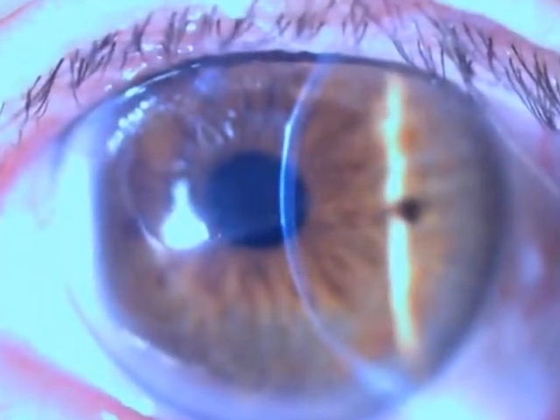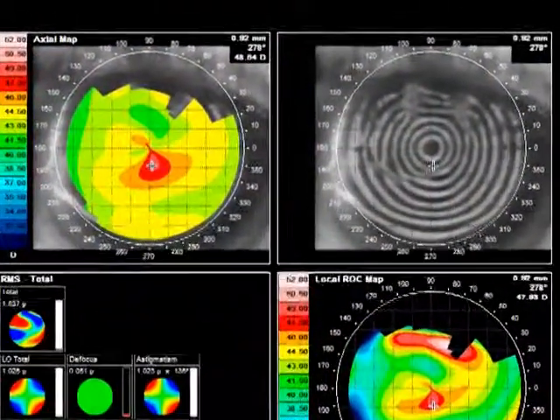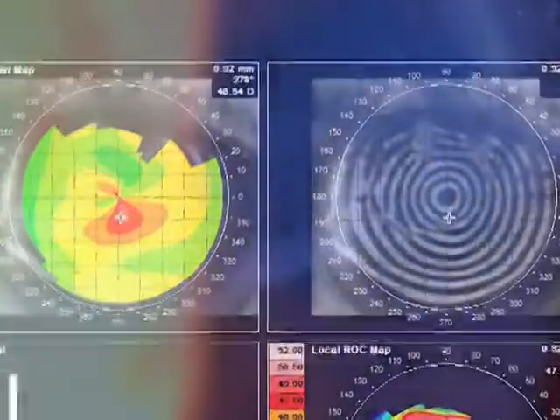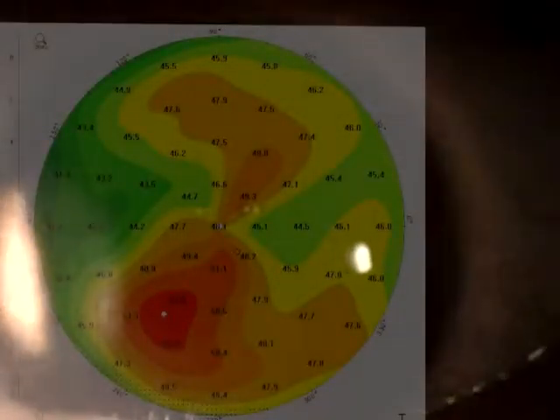When evaluating the cornea, it is crucial to rule out ectasia and go beyond anterior corneal surface topography, which may resemble or masquerade as keratoconus due to the irregularity of the ocular surface. Tomographic and biomechanical testing is critical, like in this first example of a corneal scar after keratitis related to contact lenses with myopia and irregular astigmatism.